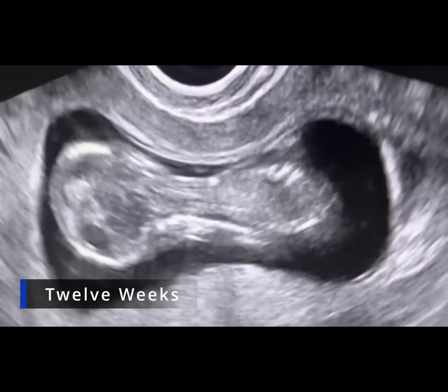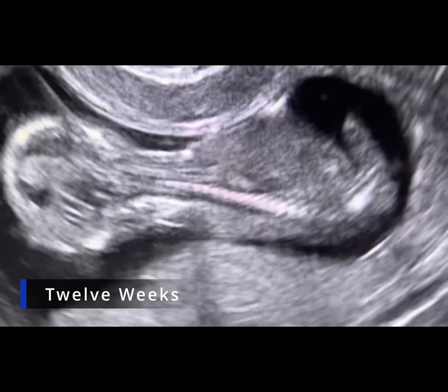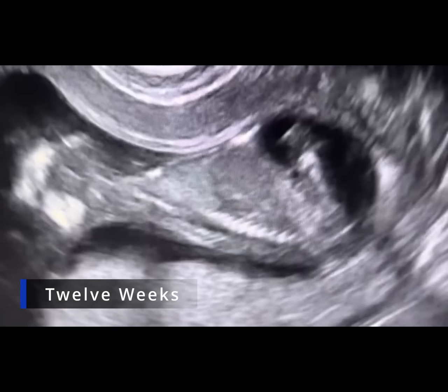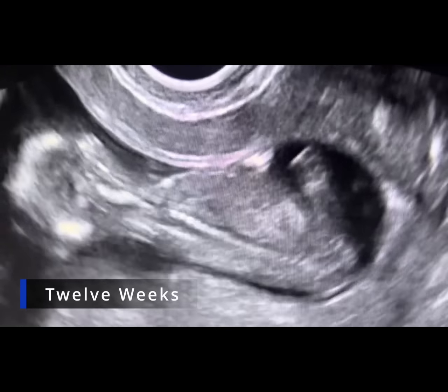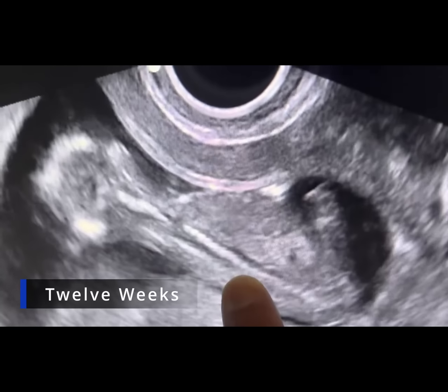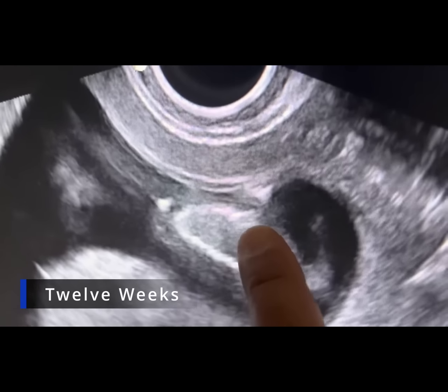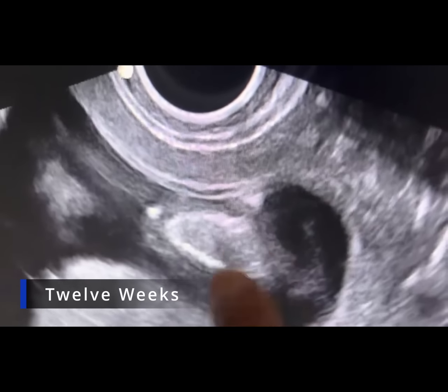Now if we look at the spine, you see the spine. And there's the spine, beautiful. And then you even see some ribs if we go back and forth a little bit. There's the spine right here. Show me the ribs, Amanda. Keep going. And there's ribs right there. You can see all the ribs.